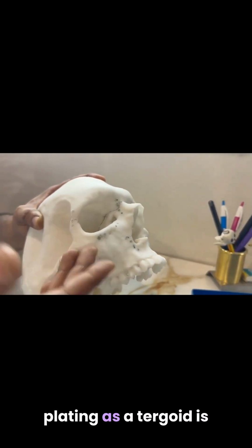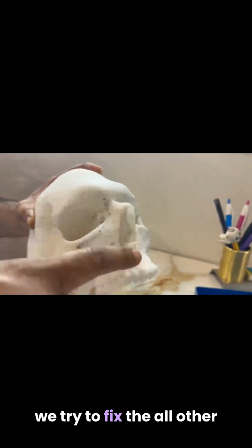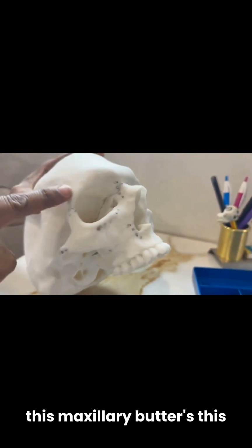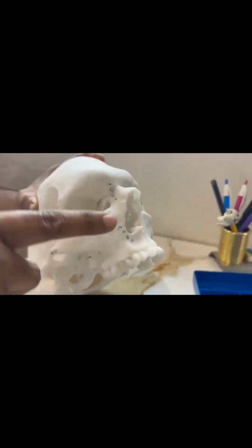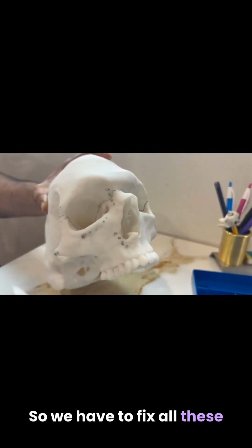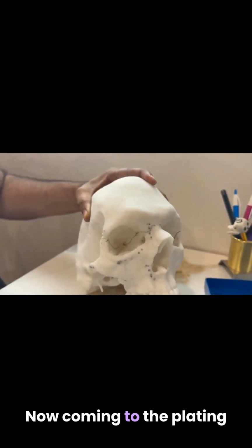But plating at the pterygoid is quite difficult and not possible. So we avoid this buttress and we try to fix all the other buttresses: the nasomaxillary buttress, the zygomatico-frontal and zygomatico-maxillary buttress, and the frontomaxillary buttress. So we have to fix all these vertical and horizontal buttresses in a Lefort 3 fracture case. Now coming to the plating.